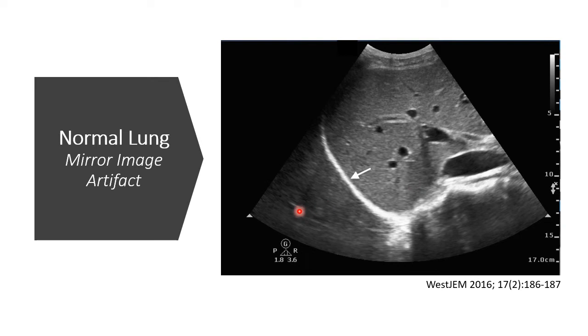So it's important to tell the difference between normal lung with a mirror image artifact and actually consolidated lung. And one way you can tell the difference is that in normal lung with a mirror image, you're not going to see the spine down below. So here is the spine, but you can see the spine stops at the diaphragm itself. And then above that, you don't see any evidence of the spine. And that's because the ultrasound cannot travel through air that is in this normal lung. Another thing you could do is move the ultrasound probe to a different direction to get a view that doesn't go through the liver first and does not allow it to reflect off the diaphragm, and then you might see that there's no consolidated lung in that area.